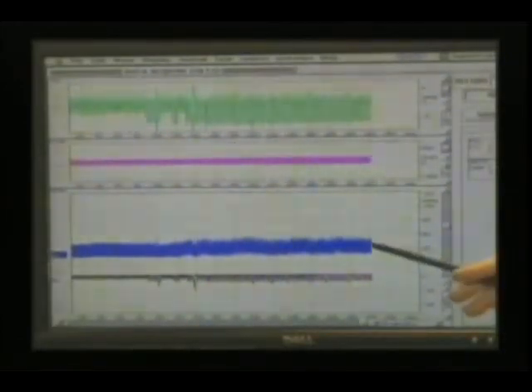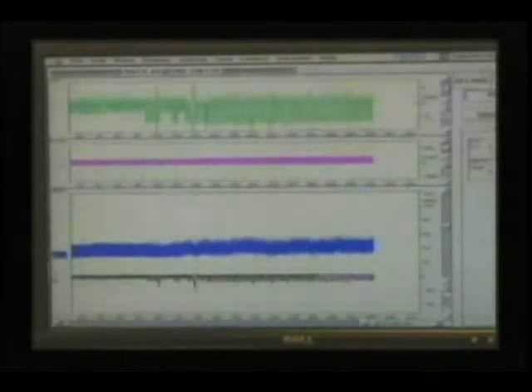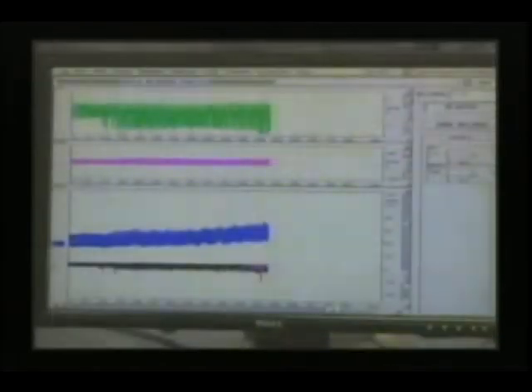As shown in blue, upon starting treatment with the ResQGuard, the systolic blood pressure began to rise. It began at approximately 50 over 30 millimeters of mercury, and within less than 5 minutes, the systolic blood pressure begins to approach 60 millimeters of mercury. After approximately 8 minutes of ResQGuard treatment, all vital signs continue to improve.